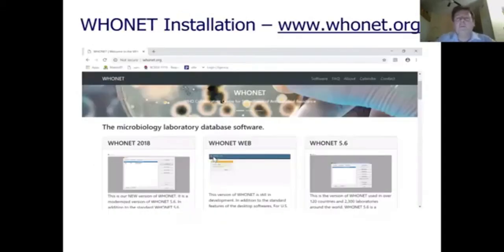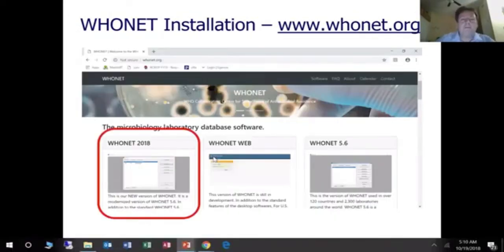So this is the WHONET web page, the WHONET homepage, and from here you can install the software. There are three softwares that you will see here. The one that we will talk about on this webinar today is the WHONET 2018 software. It is a desktop software, meaning it runs on your computer and on your local computers. It is not a web version of WHONET. It's simply a local desktop software with data entry and analysis and configuration. So that's the focus of today's presentation.